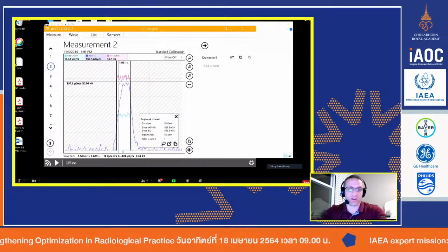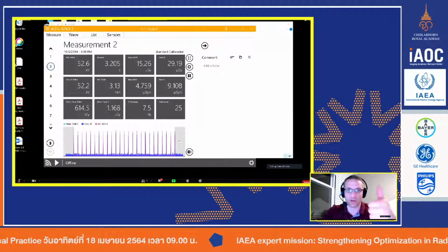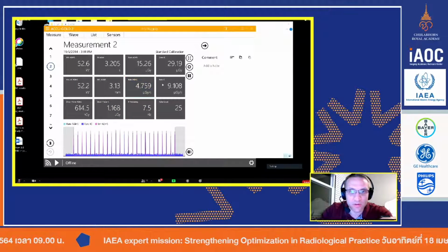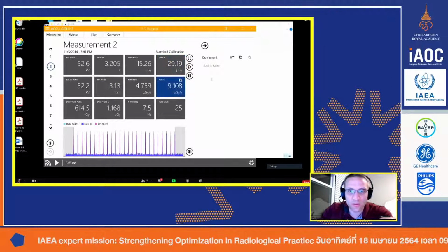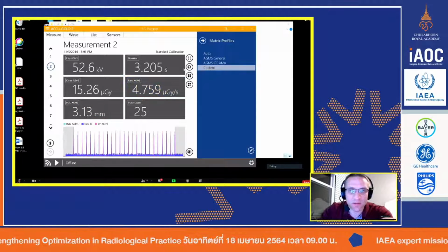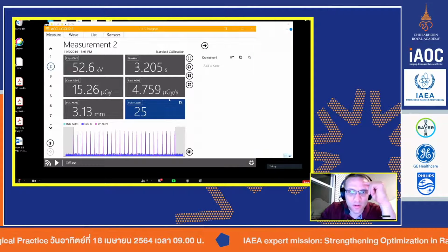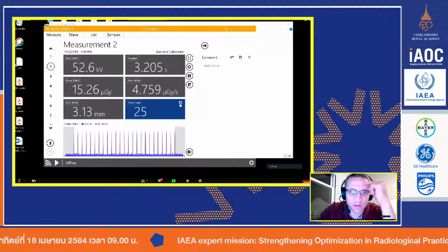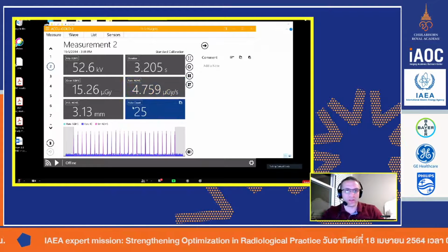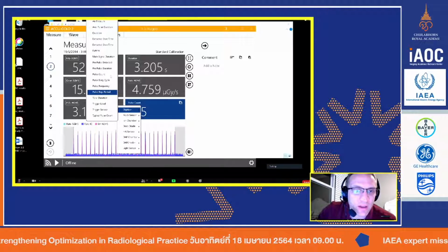So I can go in, as I said, I can go back to here and I can count how many pulses per second I'm getting. So I know what my pulse rate is. Let's see, I think that's even an option. Nope. Nope, it should give me, oh, yeah, that's not the button I wanted. Okay, one of these options would allow me to, there we go. It wasn't letting me pulse count.